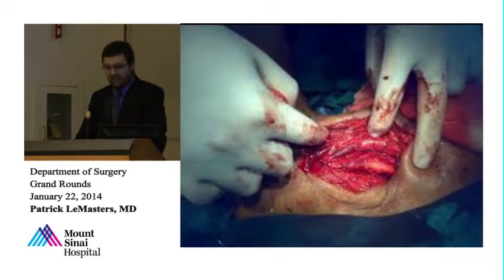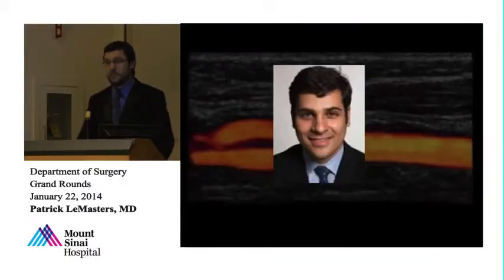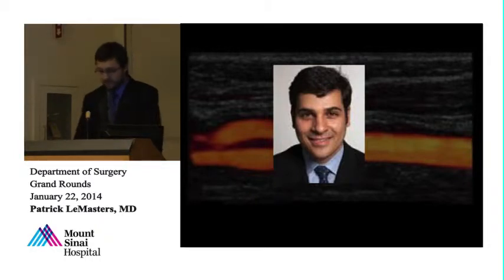So, in talking about the surgeon and the use of ultrasound, you definitely have to think of the vascular surgeon. Not only may they be better looking than us, but they're actually more adept and more proficient with the use of ultrasound. In fact, their training now includes vascular lab experience and obtaining RPVI certification, in which you have to get specific educational and professional requirements before applying and complete over 500 scans.